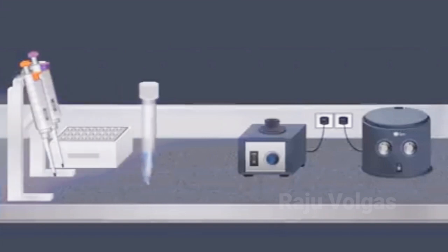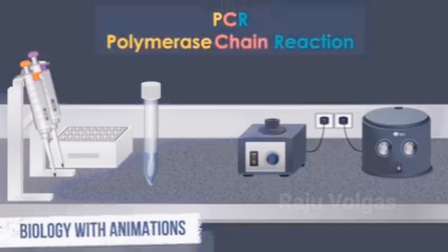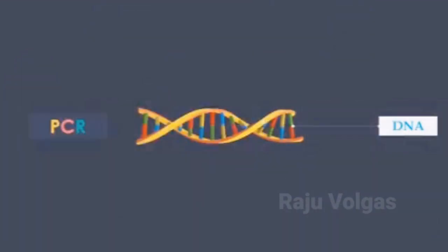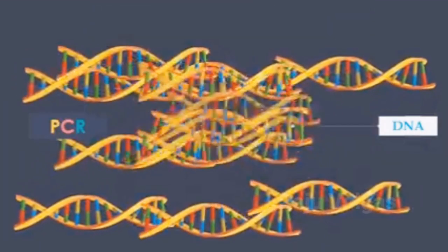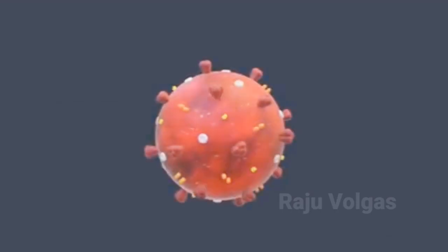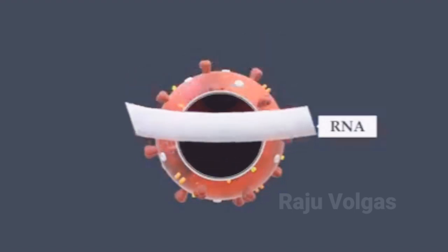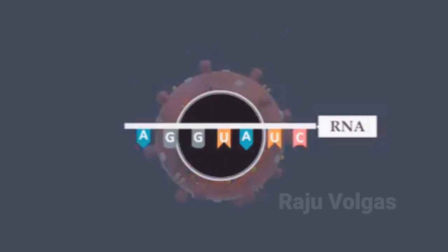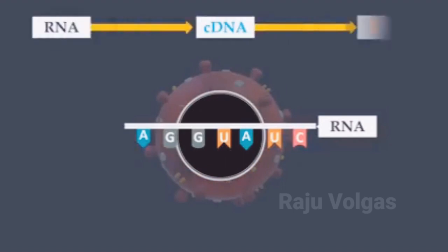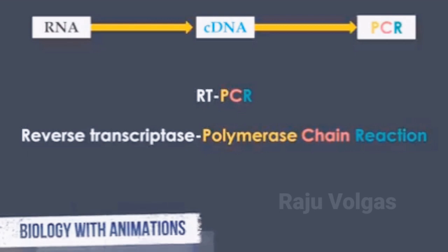The standard method of coronavirus testing is polymerase chain reaction, PCR, which is a method that is widely used in molecular biology to make millions to billions of copies of a specific DNA fragment rapidly. Coronaviruses contain an extraordinarily long single-stranded RNA genome. To detect these viruses with PCR, RNA molecules must be converted into their complementary DNA sequences by reverse transcriptase. Then the newly synthesized DNA can be amplified by standard PCR procedures. This approach is universally known as RT-PCR.